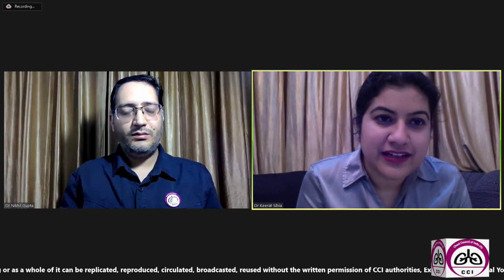Thank you. And I would like to ask you another question. Again, I think with my special interest in critical care, I tend to lean more towards such questions. What should we always look for when we find an endotracheal tube or a tracheostomy tube on a chest X-ray?